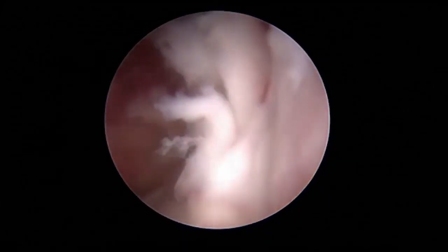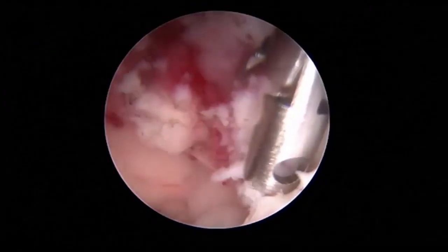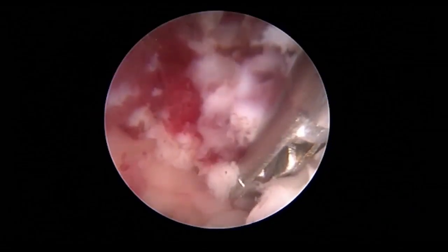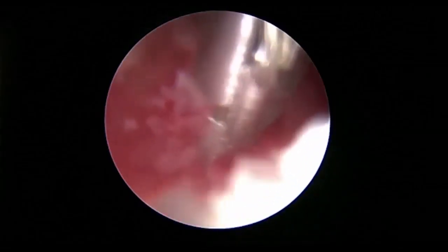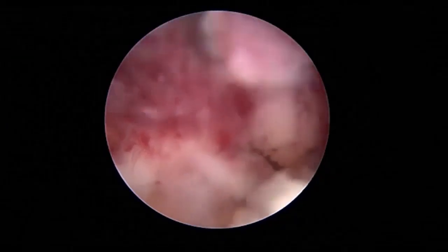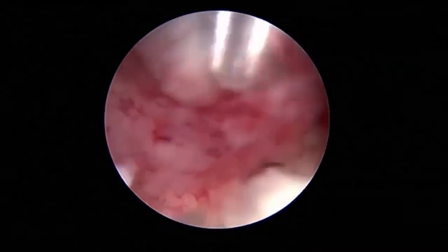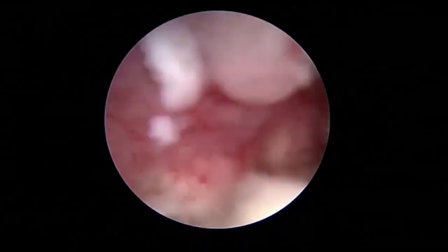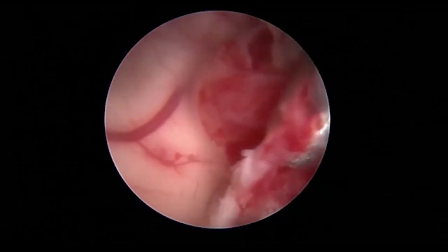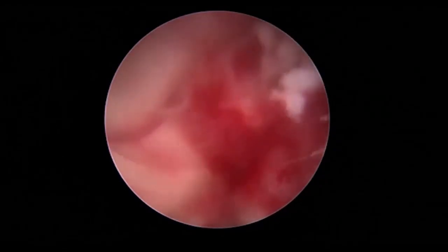Once again, this is the last attachment at the caudate nucleus, relatively vascular, requires a lot of bipolar cautery. And you can see here the end result. The foramen of Monroe, the choroid plexus, the thalamostriate vein, and the resection bed here, which was coagulated extensively. And this is the postoperative MRI showing a complete resection of this right-sided subependymal giant cell astrocytoma.